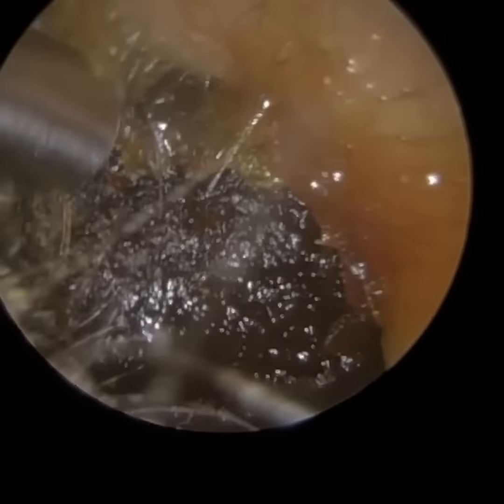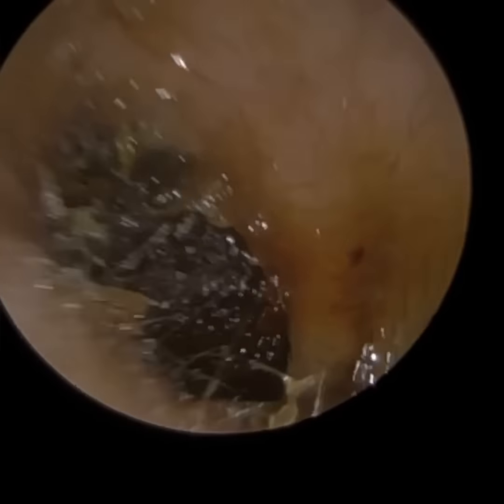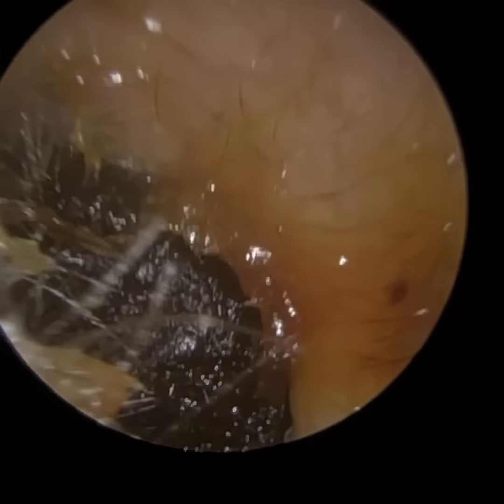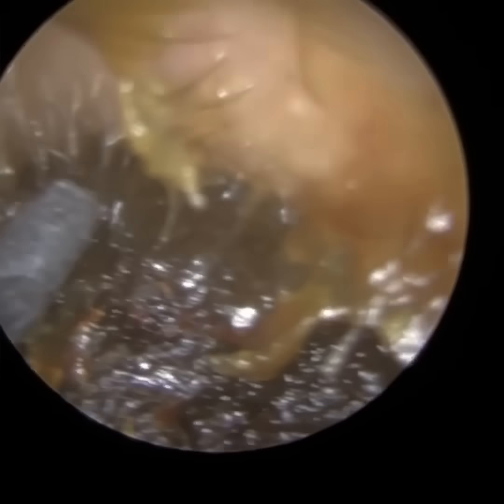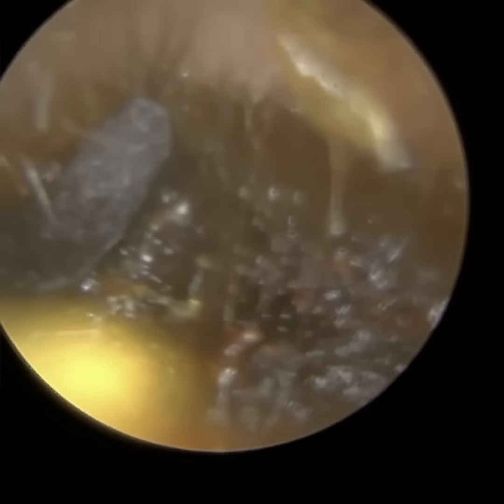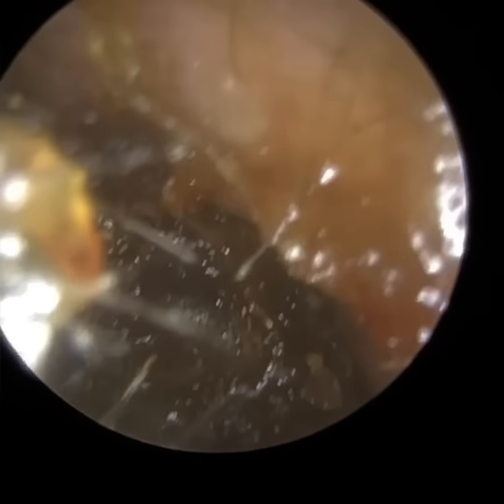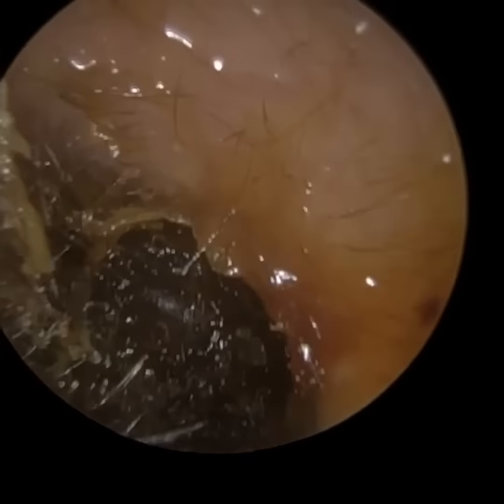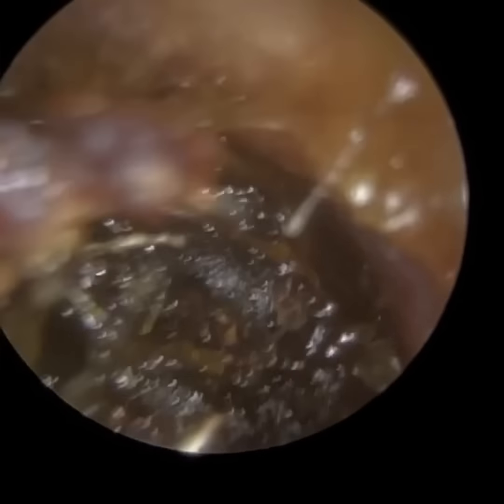I'm going to use the new Rye earhook and also the new Rye Correct to extract this, because it's just not really going to get past the curvature — the sigmoid shape of this patient's ear. The sigmoid shape is an S shape. We all have this curvature in our ear, some more than others, and this patient's got a really bendy ear canal.